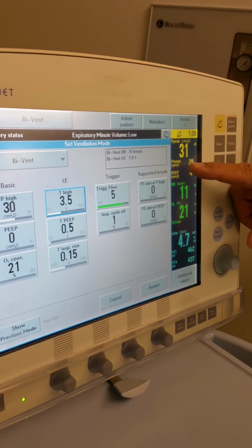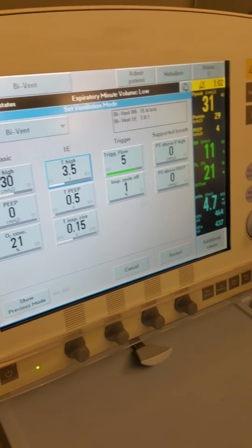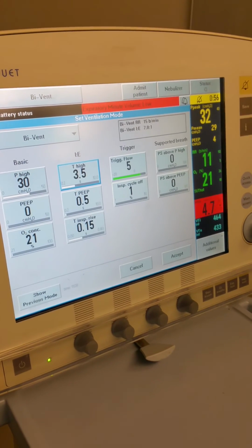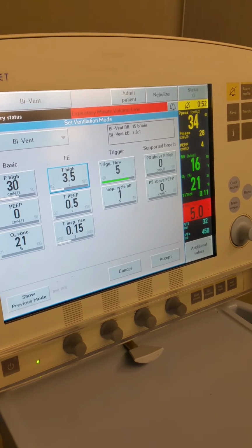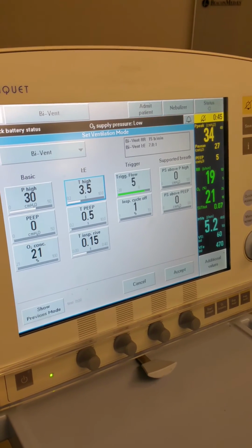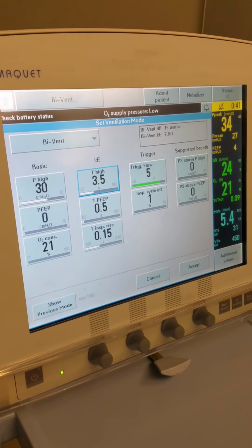So look at what my mean airway pressure is here. It's at almost 30, right? So you can imagine what that does with your intrathoracic pressure. That's why I had mentioned the patient has to be titrated volume-wise. We usually have to give them more volume because we want to have their pressure, their blood pressure, appropriate. Again, you can set the pressure support. We usually don't.